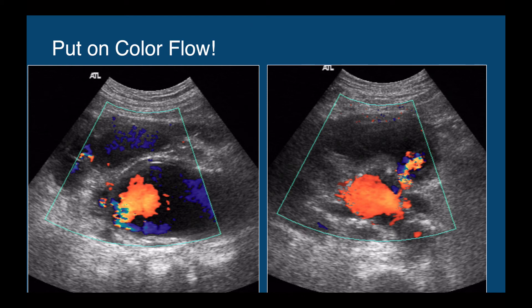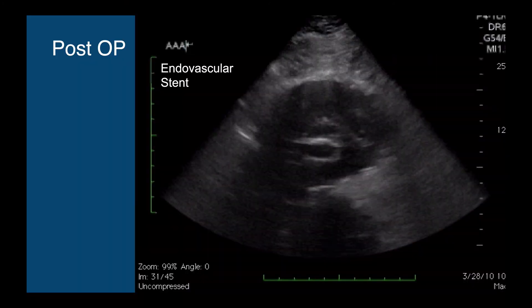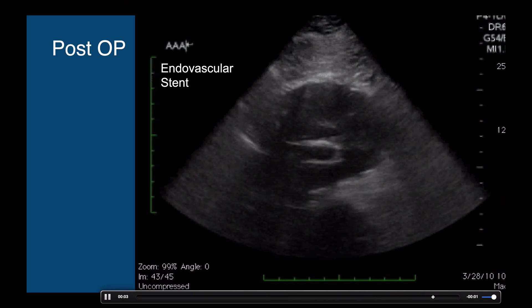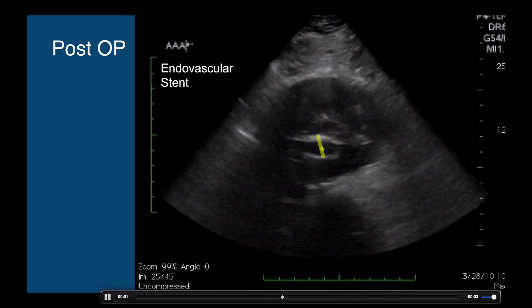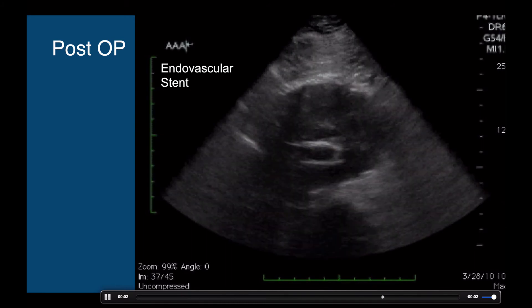If we happen to see an aneurysm, the first thing to do is put some color flow on it — after you call the vascular surgeon — because you want to know if there is active extravasation or not. In this case you can clearly see that there is. That makes the call even more urgent for the vascular surgeon to arrive in time to place an endovascular stent and repair the aorta before the patient dies.